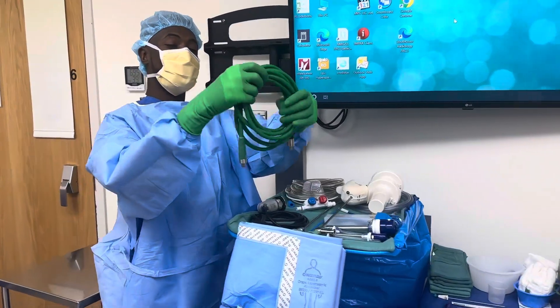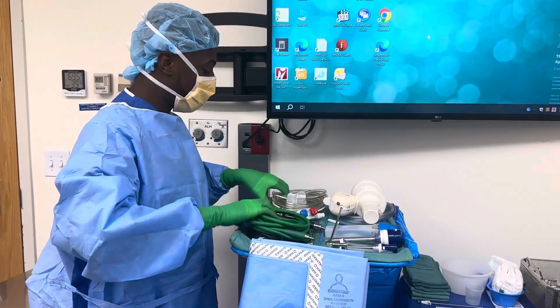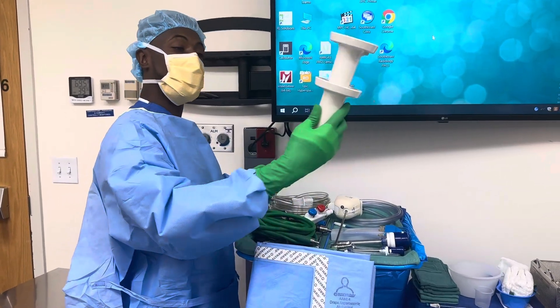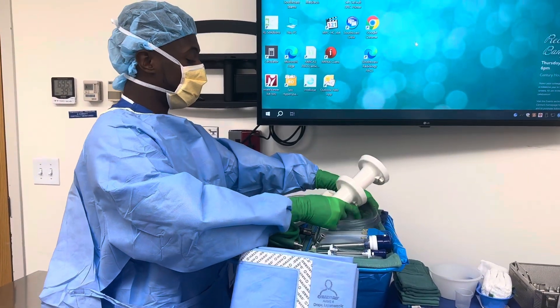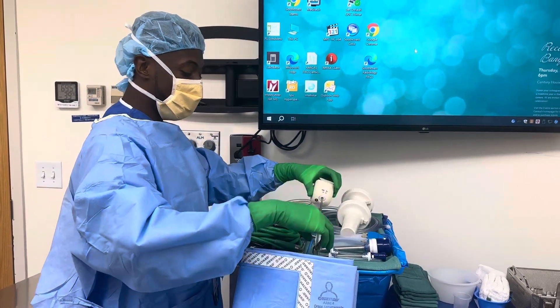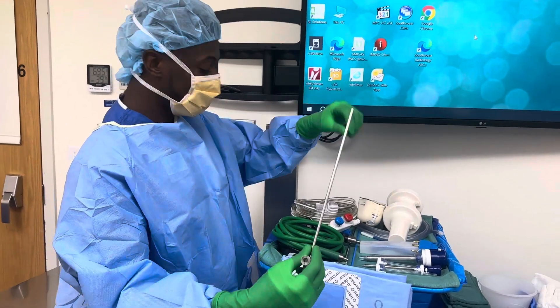We got the light cord, camera cord, we've got a suction irrigator cord, the lay handles, our insufflation tubing here, and then we also have our scopes here — we have a zero-degree scope with the flat tip.